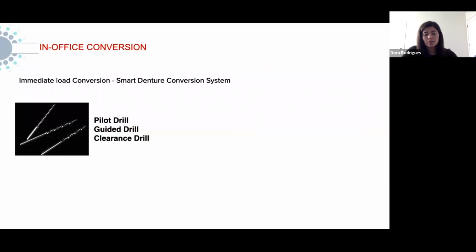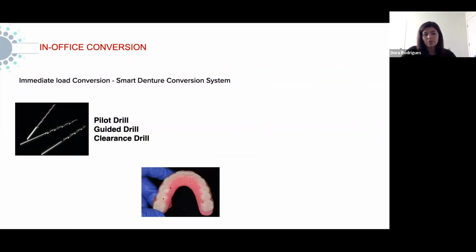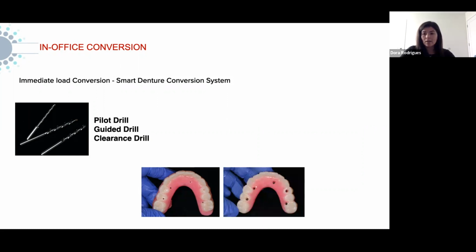And then you have the drills. The very first one is a very thin one. You go from the bottom of the cylinder. It marks the hole on top. Remember, there's no hole, so we have no clue where the screw axis is going to be. So we use the tiny one, called the pilot drill, to mark the screw axis on top. And then we use the second one just to widen that screw axis into the cylinder. And then the third one is to remove the head of that screw that was inside, protecting the cylinder. So there's no acrylic inside the cylinder at all, because the head of the screw was there protecting the interface from acrylic going in there.